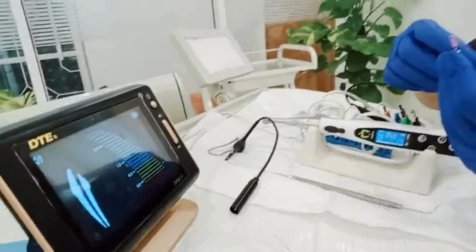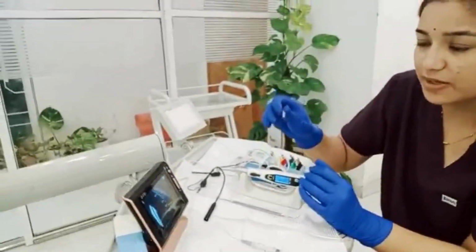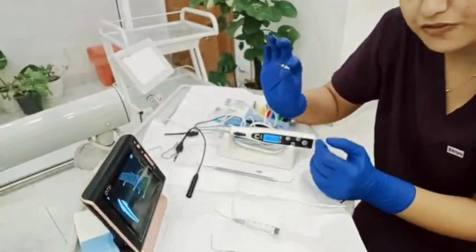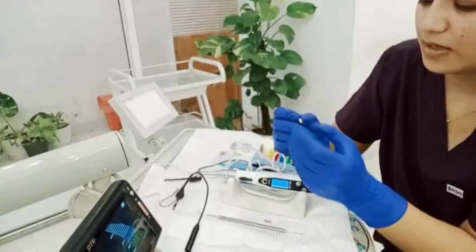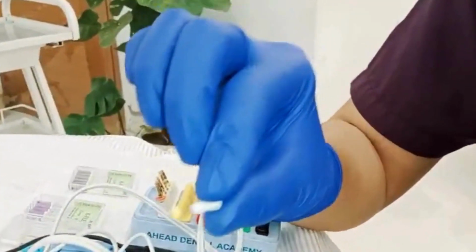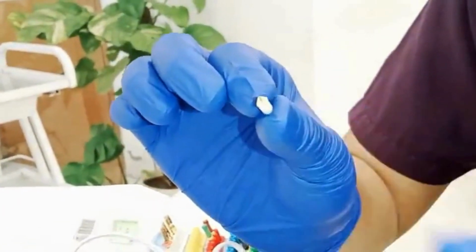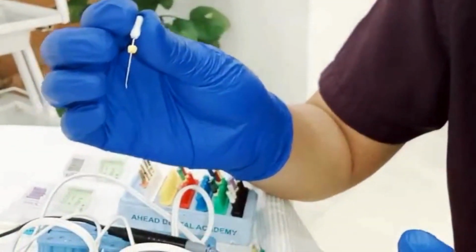Then what we'll do, after checking our working lengths on all the canals, then after 10K file we'll use 15K number file. Okay, we'll do this pre-curving. Always whenever we are using the hand files, either it is 10 number or it is 15 number, we'll be pre-curving the files. Okay, so this is the 15 number file, which will be enlarging the canals after 10K number file.